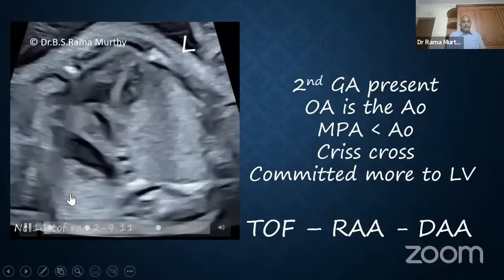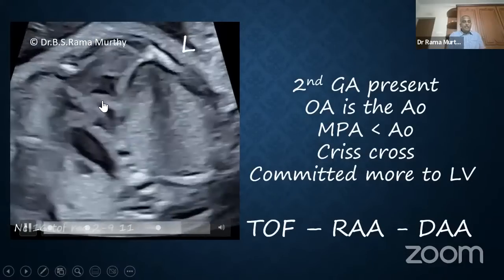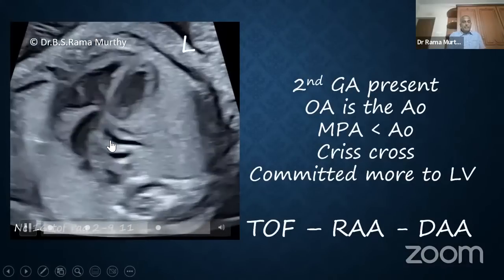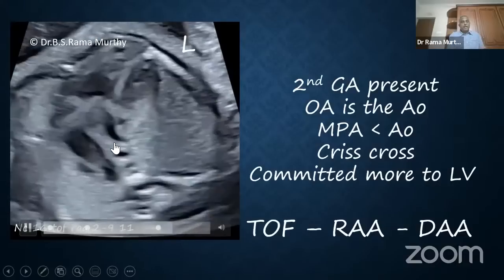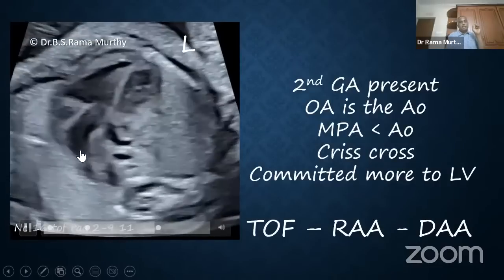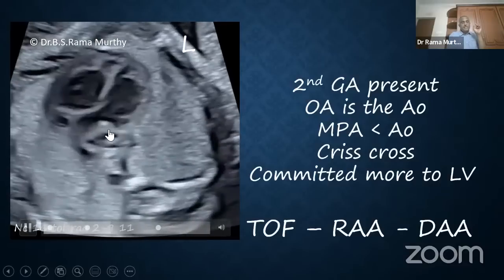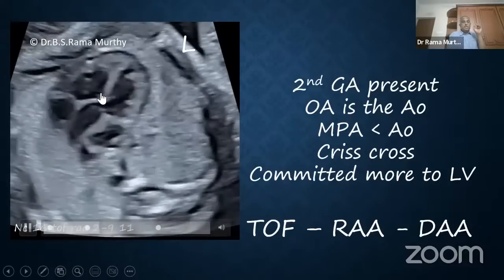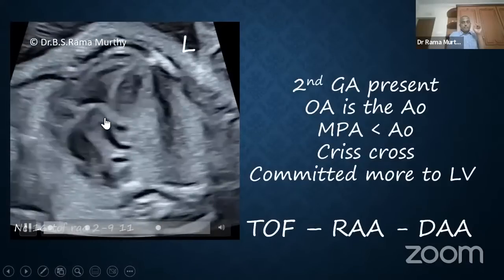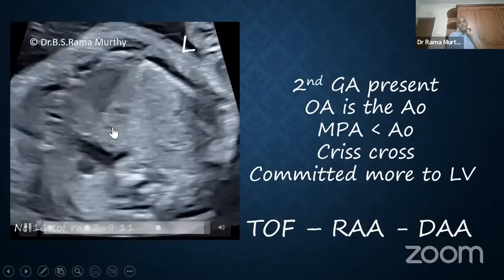You can see both the ventricles are committed. And is there a second artery? Yes, I draw your attention to this chamber, which is the right ventricle. This is the spine, substernal right ventricle, and you see a second artery which is coming in this fashion. Right? The second artery, so we have already finished answering the overriding artery looks to be the aorta. And I want you to see what is happening to the second artery, which is narrow, which is coming from the substernal right ventricle. What is happening to it? It is dividing, and it's dividing in the axial plane. So this has to be the pulmonary artery.